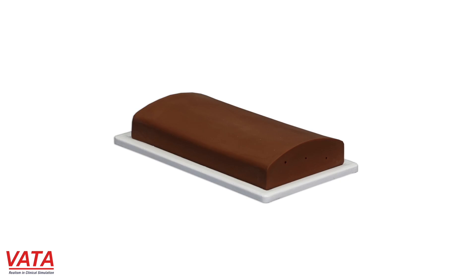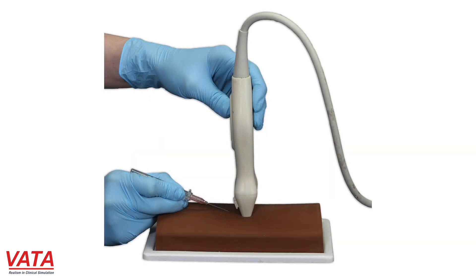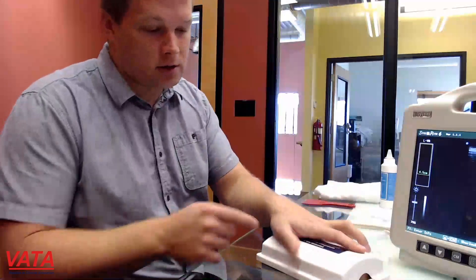These models should last for a long period of time. When you're done, we definitely recommend just wiping off all of the ultrasound gel that you are using. Just like our previous model, for storage you definitely want to make sure it's in the base and then put the cover on. This material is even a little bit softer than our other material.